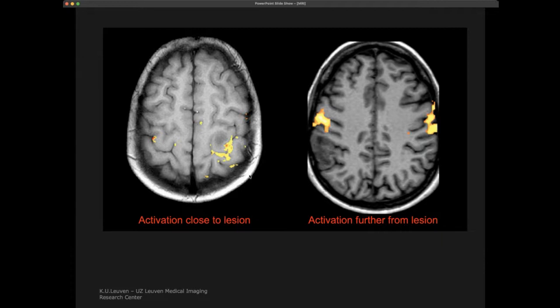And so when you do this activation and you measure, you see that in this patient, this is very, very close. So if you want to cut away this lesion fully, you have a very large chance that you will actually damage the part of the brain that is doing this certain function. While in this patient, you see, look, we are reasonably far away, and it's unlikely that we damage some structures, or at least the structures that we specifically want to preserve.